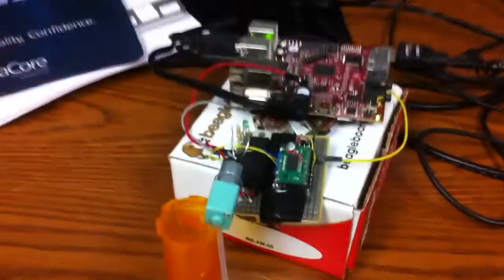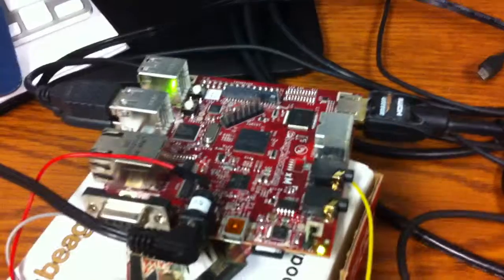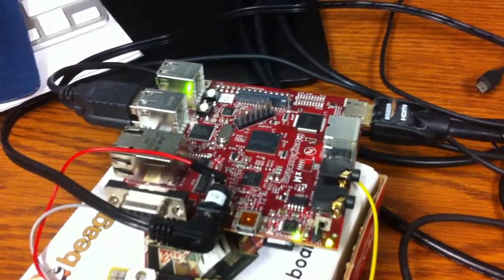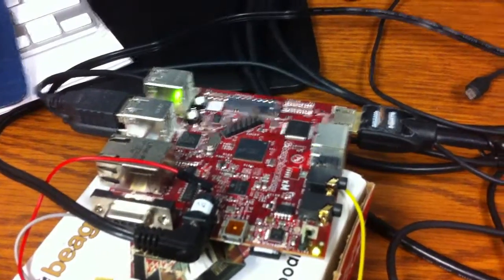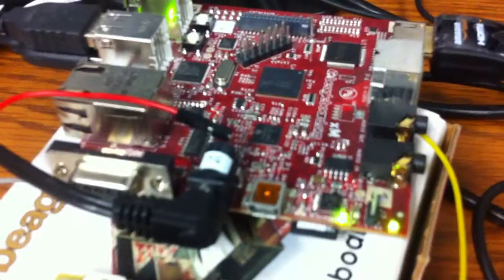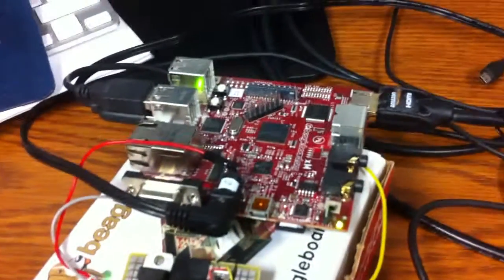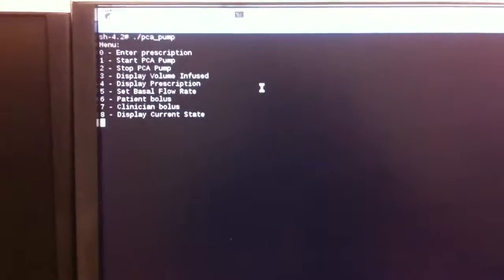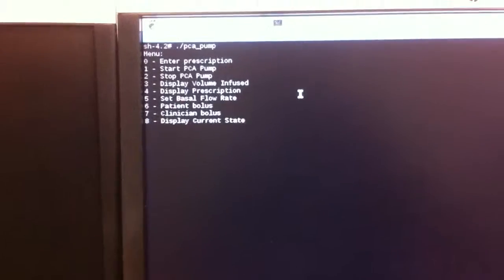vein. The BeagleBoard is a computer board created by Texas Instruments. It has a 1 GHz processor, half a gig of RAM, and what is nice, there is an HDMI port and an SD card which enable running Linux on this board. So here is the PCA pump console on Linux, and in order to start I need to enter a prescription.